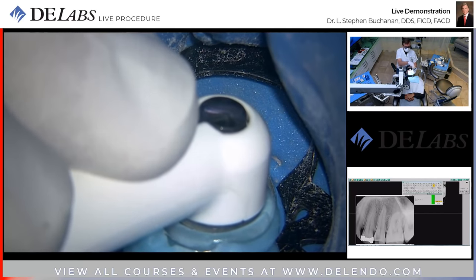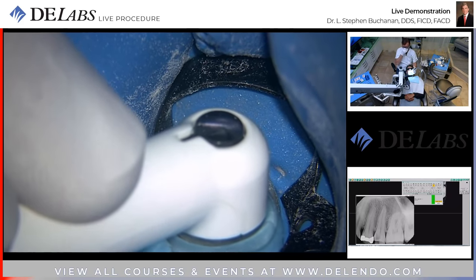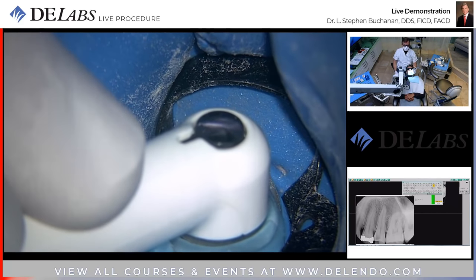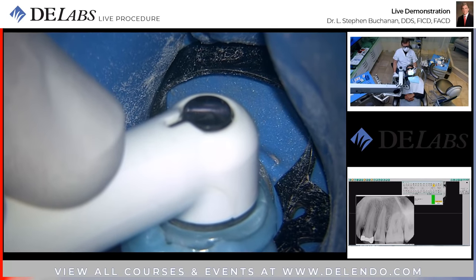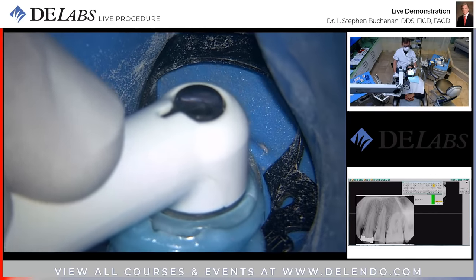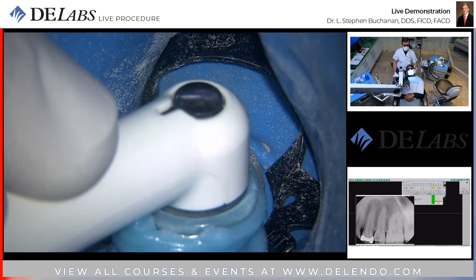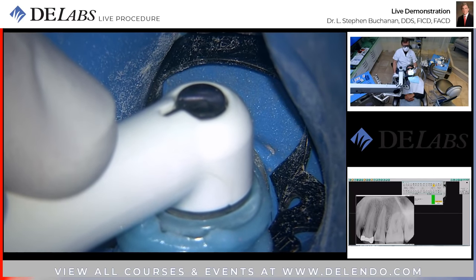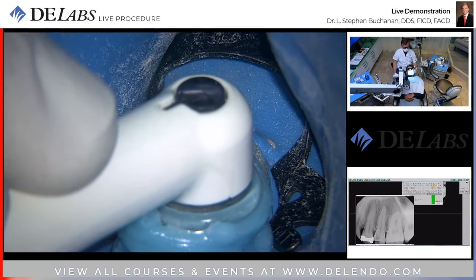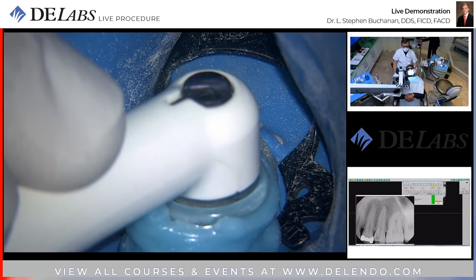So whereas in times past we might have feared a bleeding canal because it usually meant that we'd done something wrong, that we'd perforated the tooth, or, we all fear a hypochlorite accident, this bleeding is virtuous. Most people who get used to it and learn not to worry about it just wait it out for 3 to 5 minutes till it stops, and will be most concerned after they get through that experience with a tooth that doesn't bleed after root canal treatment or after GentleWave. Okay, we're at 4.5 minutes.